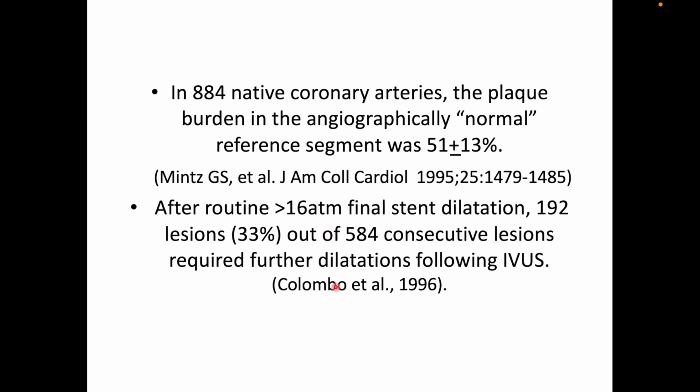And then Antonio Colombo also demonstrated that after routine more than 16 ATM final stent dilatation, so most of us feel very comfortable that we've dilated the stent to 16 ATM, so now the stent is well deployed, no issues. So what he demonstrated was that after more than 16 ATM stent dilatation, 33% of these lesions required further dilatations following IVUS. So when you do the IVUS, you realize that the stent is either not well expanded or it's not well opposed, and you need to further post-dilate the stent.